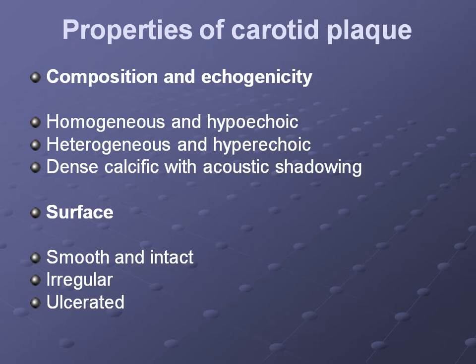When you see a plaque, you should report the following: composition and echogenicity. Is it homogeneous hypoechoic, heterogeneous hyperechoic, dense calcific with acoustic shadowing? You should report the surface. Is it smooth and intact? Is it irregular or ulcerated?